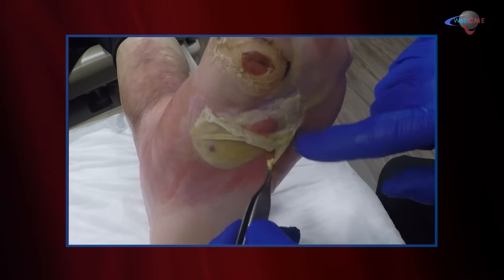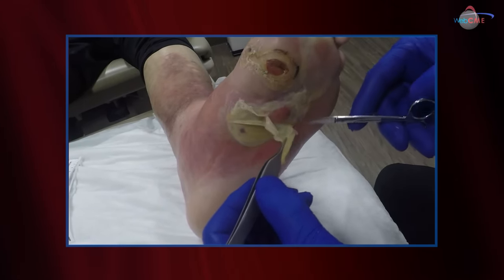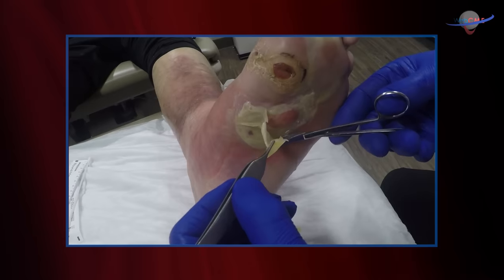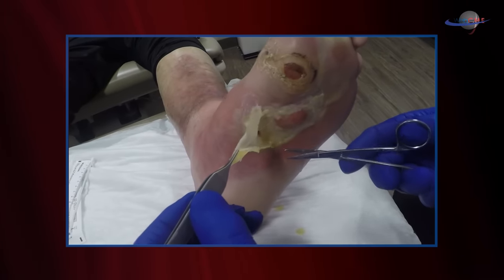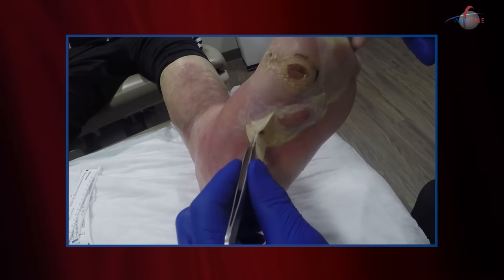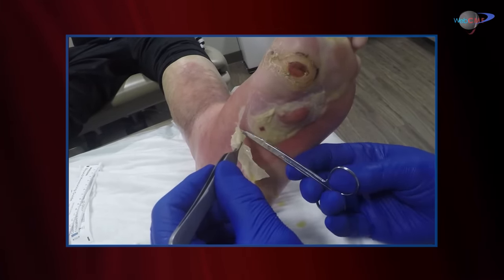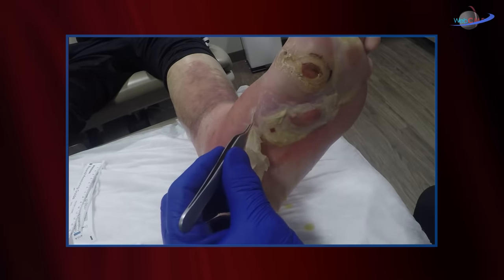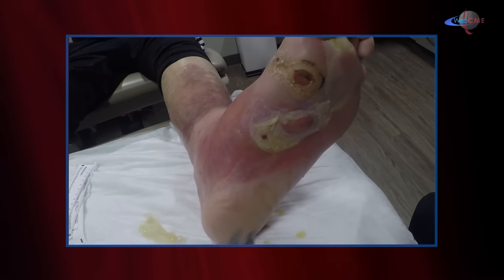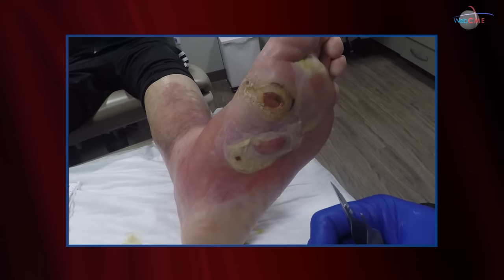We have purulent drainage coming from this area. It's just laden with fluid — a great culture medium for bacteria. This is probably some ischemic, some inflammatory, some infectious change that we're noting here. I've unroofed the blister, and I'm going to debride this gently.